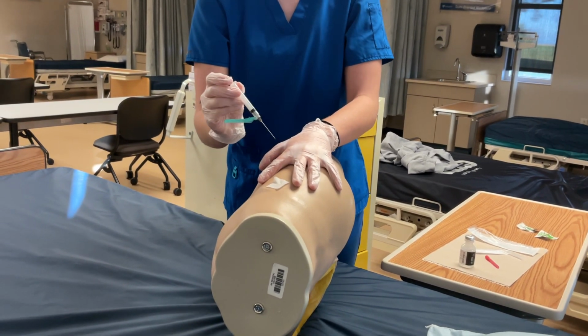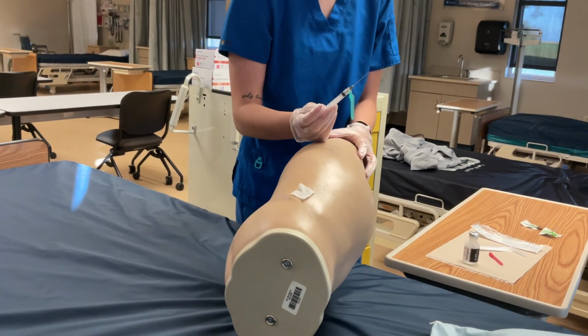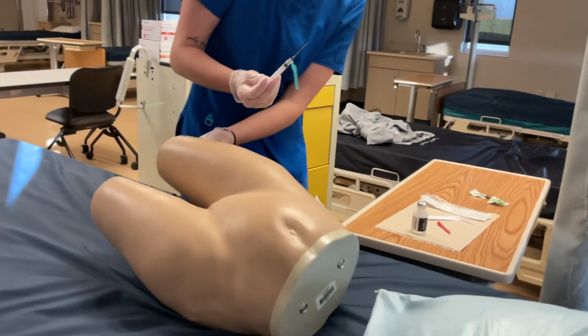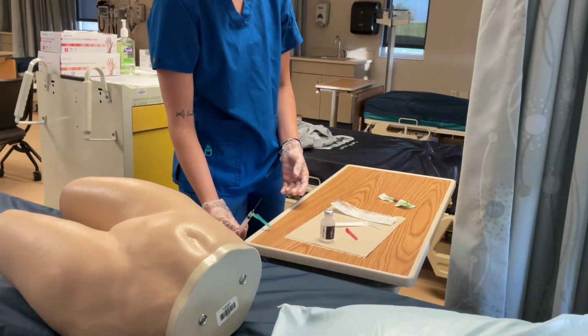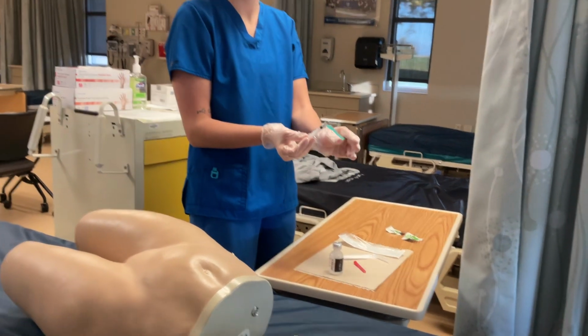I would put this on the safety. I would do it on a hard safety surface, and then put in a sharps container.